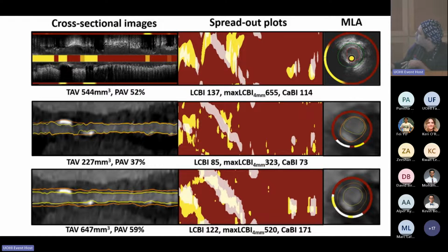This is after deep learning. You can get slightly closer to what your reference standard is, albeit that may not be a perfect metric, but it's as good as it gets in vivo, and you can improve your prediction just by trying to train it off of intravascular imaging.